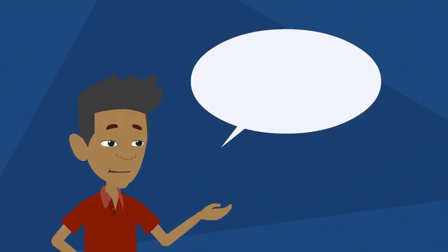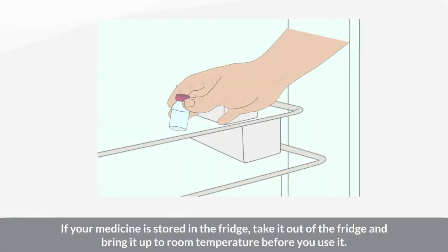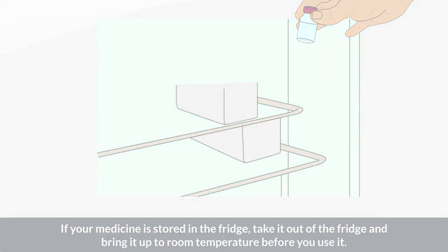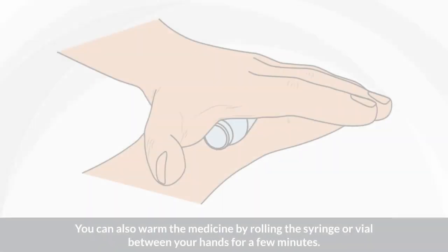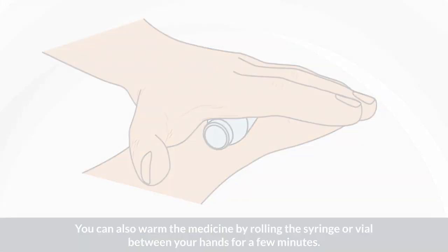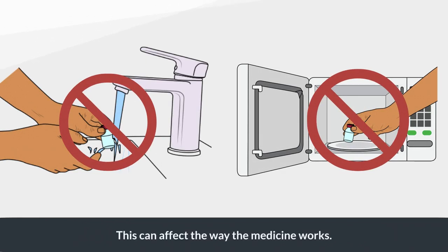If your medicine is stored in the fridge, take it out and bring it up to room temperature before you use it — this will reduce discomfort during injection. You can also warm the medicine by rolling the syringe or vial between your hands for a few minutes. Do not put the syringe or vial in hot water or the microwave, as this can affect the way the medicine works.